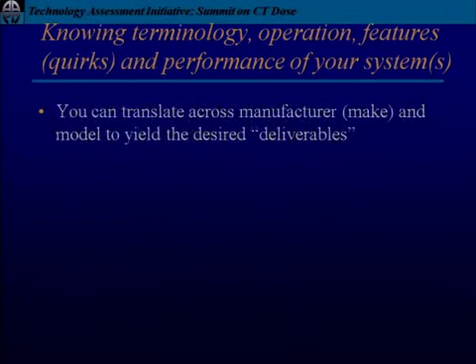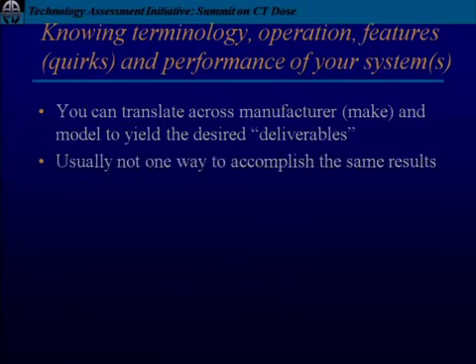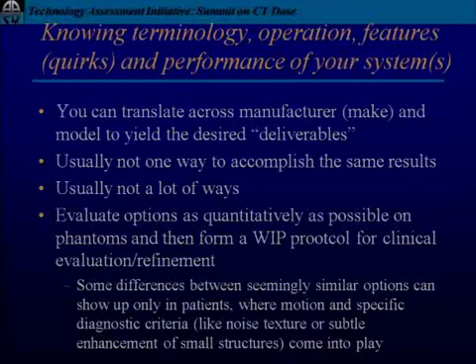So when you know those things, then you can do the translation task. And I think someone asked Jim Kofler how long this took us. It's all that part of knowing what you want and the background knowledge of knowing the scanner. But once you know that, plugging in the protocols is actually not the time-consuming part. And there's not just one way to accomplish the result, but there's usually not a lot of ways. There's some sort of convergence of reasonable ways.